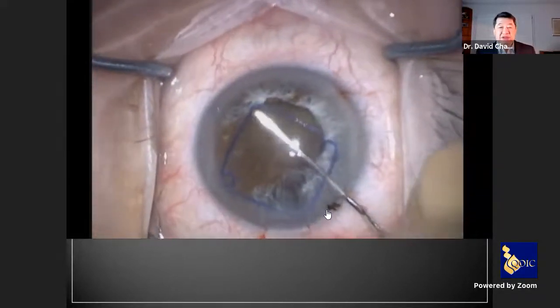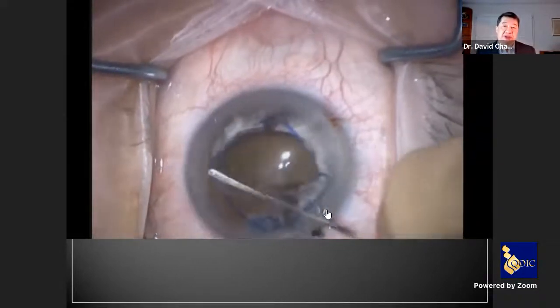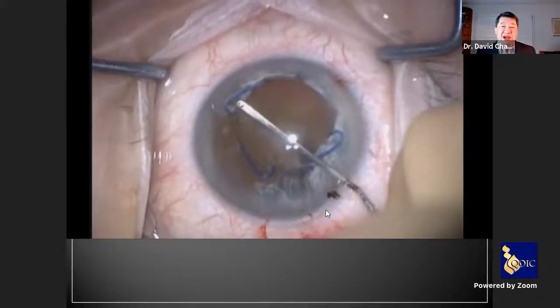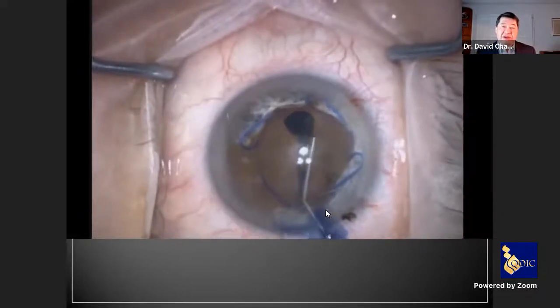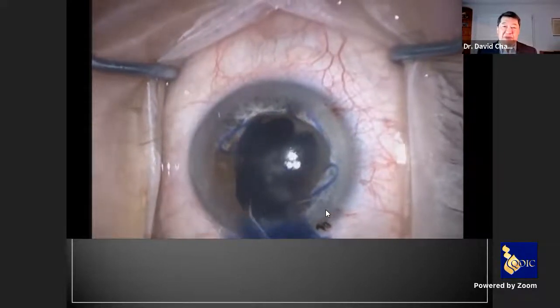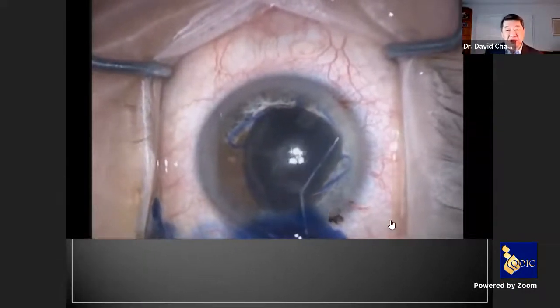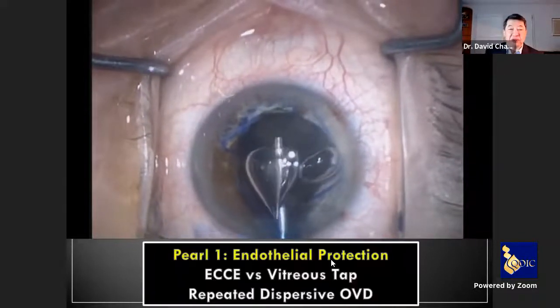I do have to do this very carefully now because when I put in that last corner, it will stretch the pupil, as you'll see here. But the advantage of the Malyugin ring, unlike the iris hooks, is the pupil will not get further stretched inadvertently during the surgery. Now, I have no red reflex, so this is the point at which the pupil is larger. I can put in my trypan blue dye, try to get right up against the capsule, a little bit just under the pupillary margin, because pearl number one is we have to be able to see.